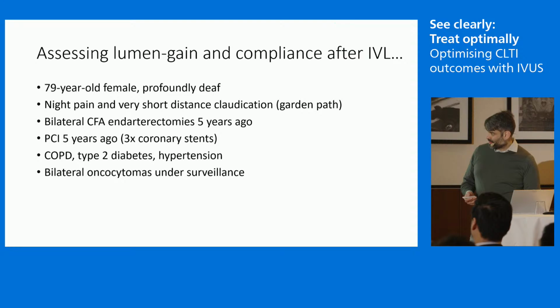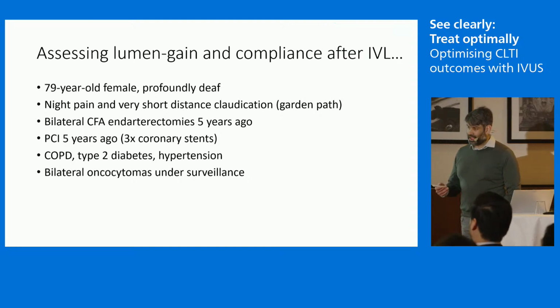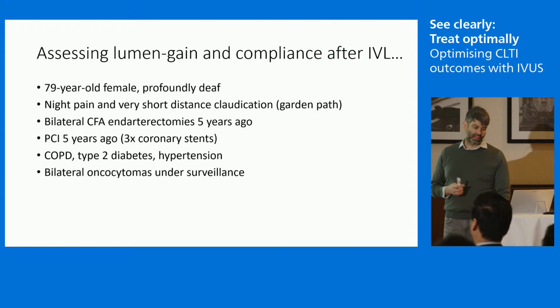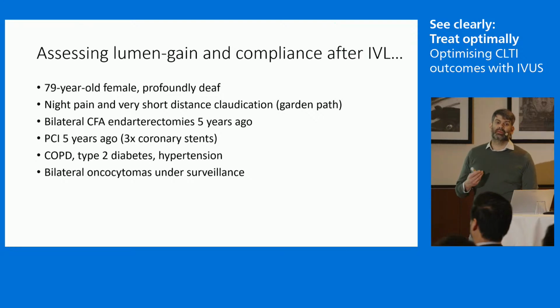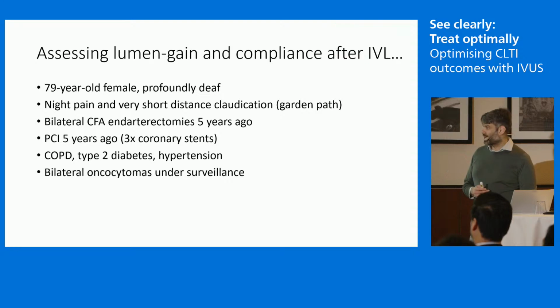So we have this problem of calcium. We have potentially some tools to deal with it with atherectomy and IVL, but what we really don't have, or didn't have until we had IVUS, was a good way of assessing the right tool and how well that tool is working. So I'm going to show you some cases just to show in practice how IVUS helps us assess that, and maybe gain some insights about what these tools are doing to the vessel wall when we're using them, and how that guides our treatment.